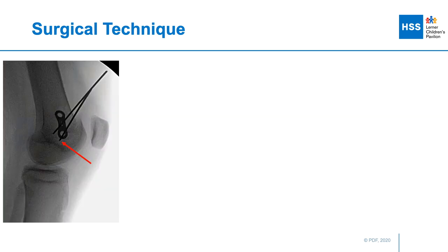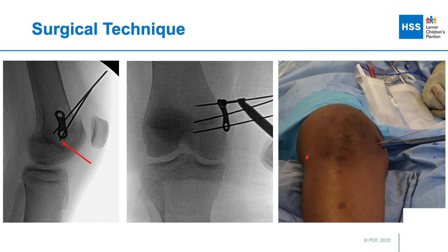After placing the epiphyseal guide wire, I go to a perfect lateral projection of the knee and ensure that the tip of the guide wire is contained anterior to Blumensaat's line and posterior to the lateral projection of the deepest part of the trochlear sulcus. This ensures that the eventual screw will remain completely interosseous and not violate the notch. I then go back to the AP view to place the guide wire for the metaphyseal screw and measure both guide wires to obtain the appropriate screw lengths.